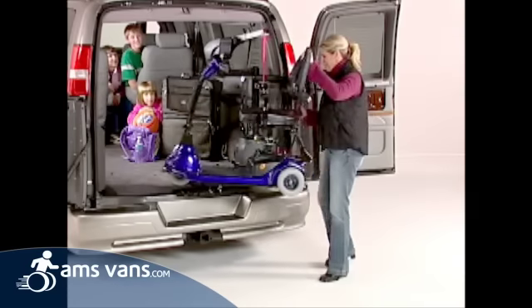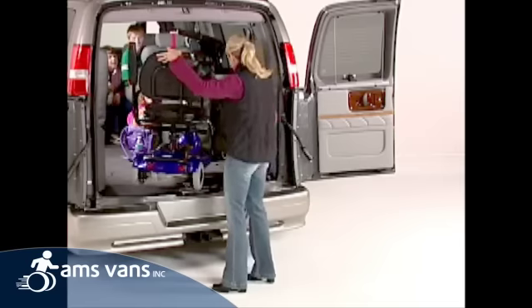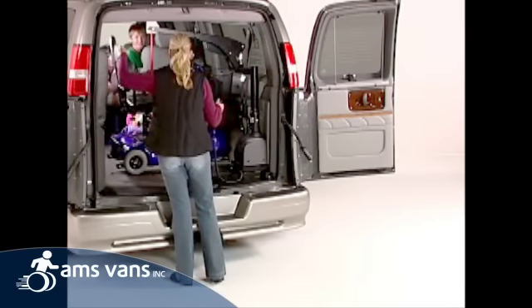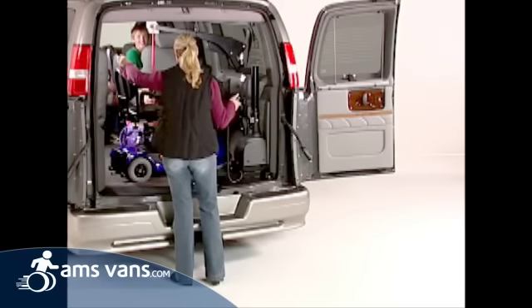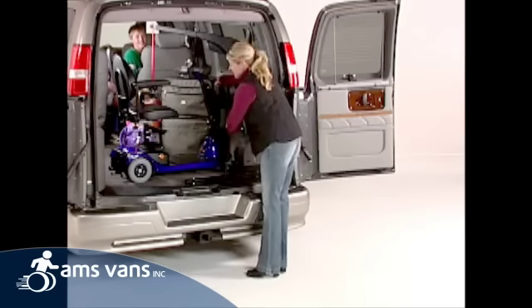Push the in button and the Curbsider moves the scooter inward at a comfortable speed. Simply guide the scooter into the rear opening and position it for storage. Once inside, lower the scooter to the floor, leaving the C-Arm attached to secure the scooter during travel.